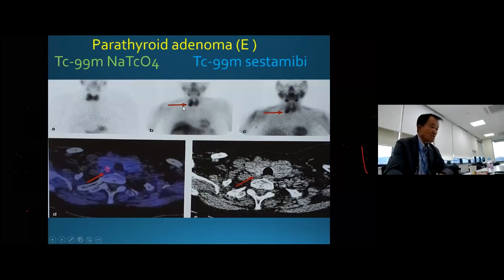Okay, here's some more technetium subtraction you can see here. So in old days, the CT was not a good CT, but at least on this color, right behind the right inferior thyroid pole right here, the esophagus is right here. If this one comes a little bit further back or near here, that's a C type. This is more like an E type.